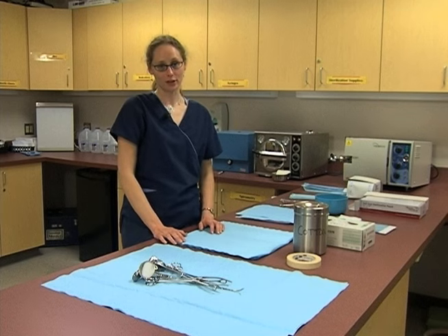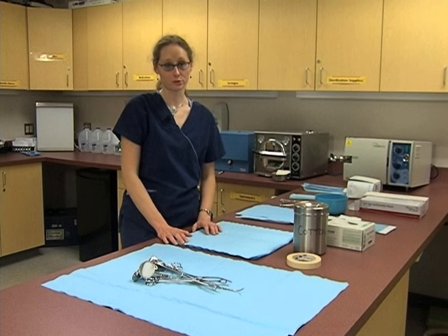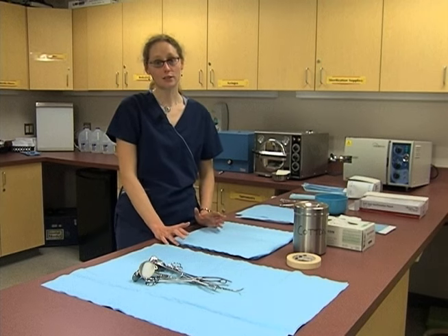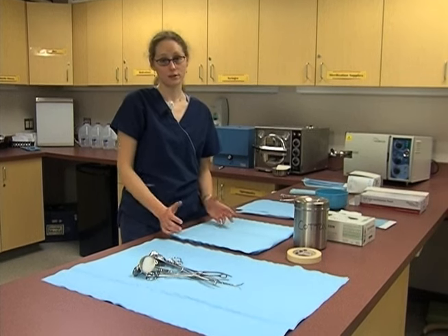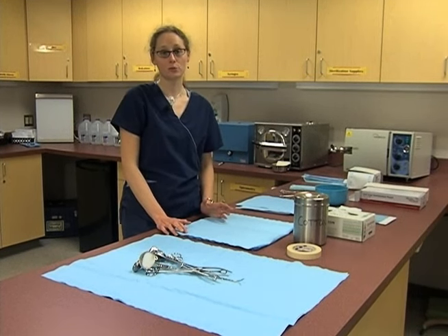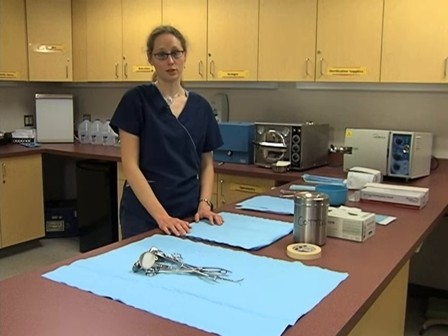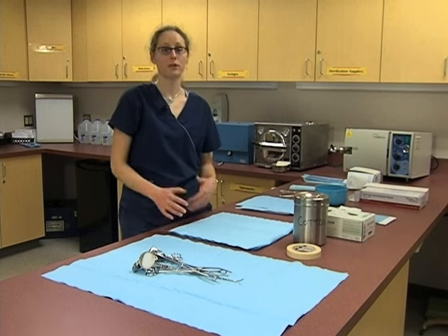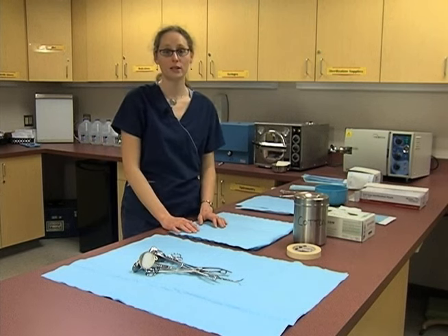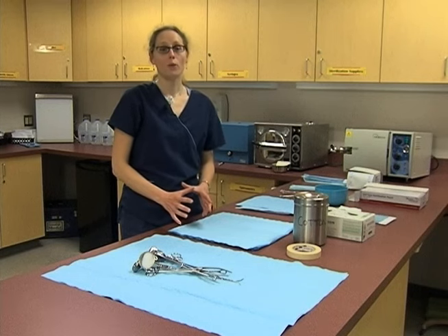So we're going to take a look at how to run an autoclave and how to prepare surgical tools for the autoclave. In a doctor's office, there are a variety of tools that need to be used for non-sterile procedures and for sterile procedures. There are certain ways that we must prepare these tools before they can be used in the office. And of course, after they're used, we're going to be cleaning them again before we can be putting them through the autoclave.